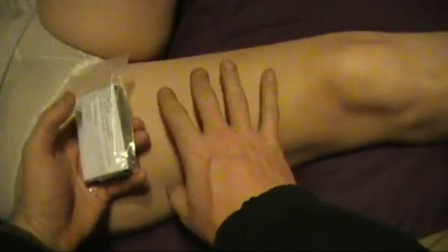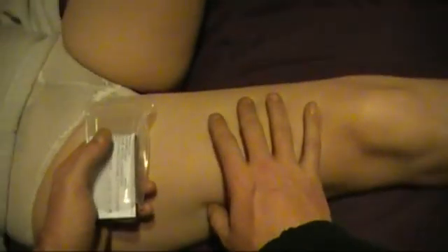Adapt and improvise, okay? Anything can be used as a tourniquet. If it's cloth and it's strong enough, okay, it can be used, okay? I can go and whip off one of my socks right now, tie it around here, stick a windlass through, crank it down, and it'll work, okay? You should have 90% of what I'm going to be showing you guys, you can accomplish with a pocket knife and what your patient is wearing. Well, not necessarily what my patient is wearing, but what your normal patient is wearing.